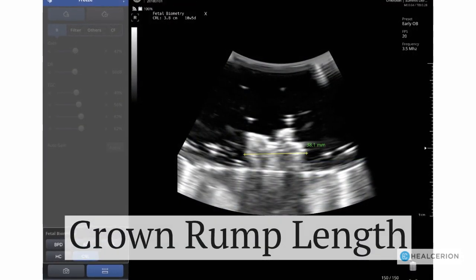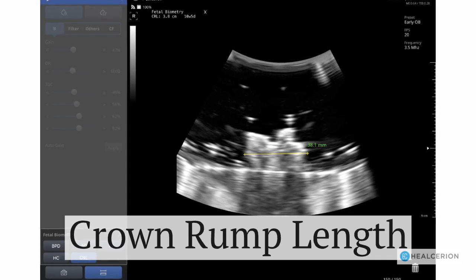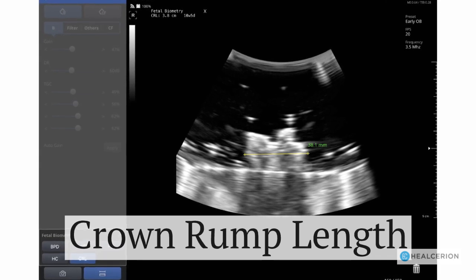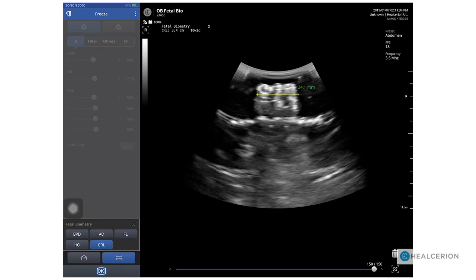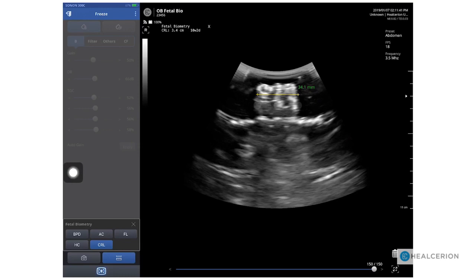Let's start by doing a crown rump length using a phantom. Once you've achieved the correct image, freeze and go to the fetal biometry menu. Choose crown rump length and then place the calipers at either end. You'll notice in the top left corner of the image the measurement is displayed with the corresponding fetal dating.